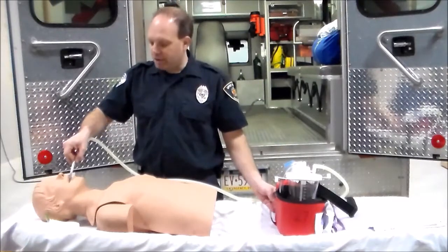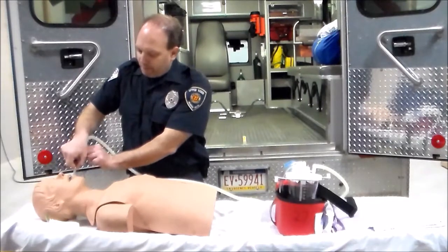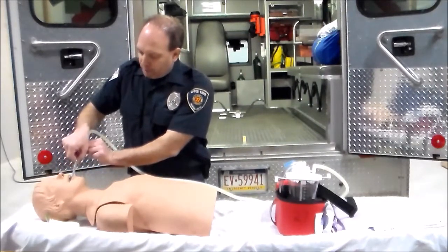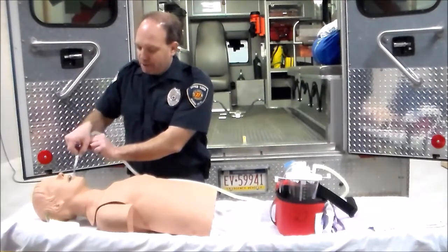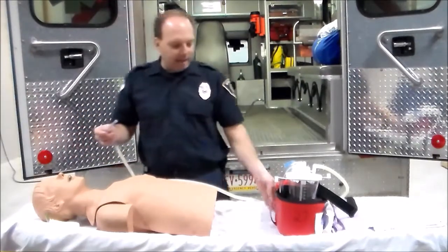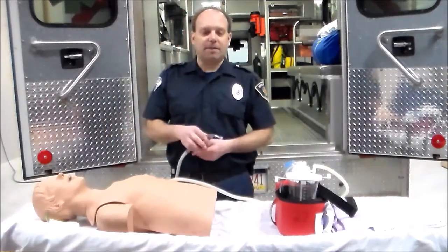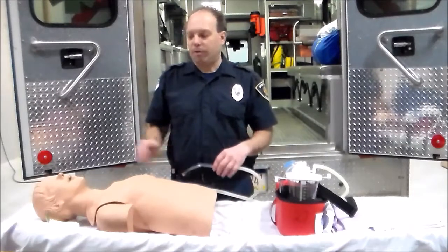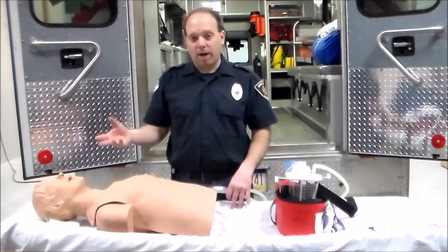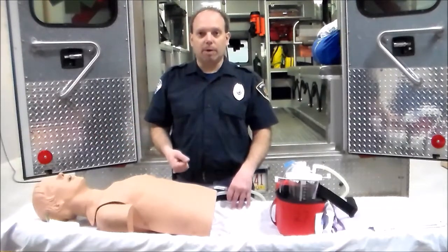We then insert the catheter. Once inserted, I'm going to cover that port. I'll sweep back and forth until I've removed all secretions. Typically we do not want to do that beyond 10 to 15 seconds — 15 seconds at the max. As long as there is fluid in their airway, we cannot effectively ventilate them and they cannot effectively breathe.